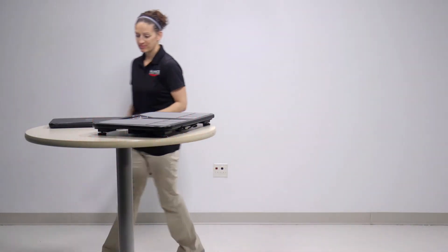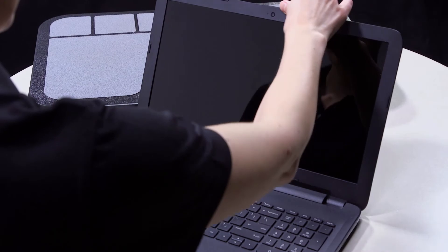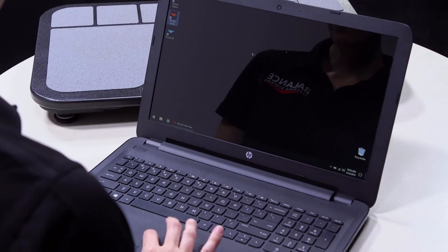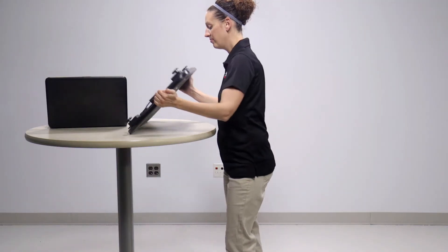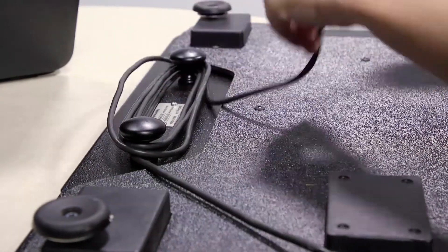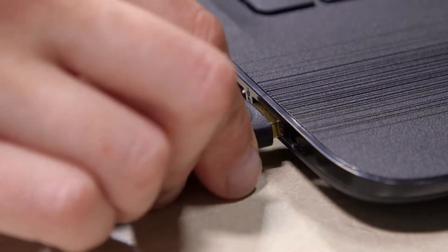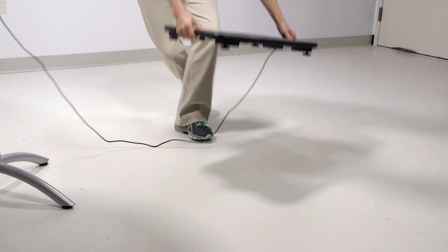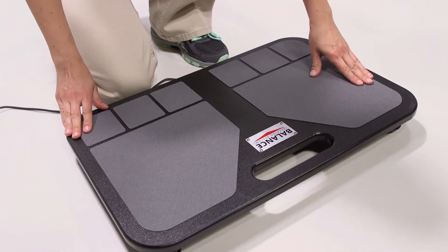To begin, find a quiet space with hard flooring or low-pile carpet to perform testing. Turn on your computing device and double-click the B-Tracks software icon on the desktop to open the software. Unwrap the cord on the B-Tracks Balance Plate and plug it into any available USB slot. Place the B-Tracks Balance Plate on the ground.